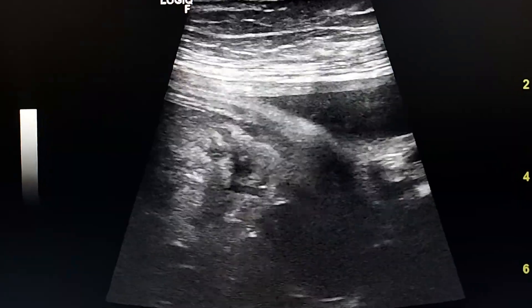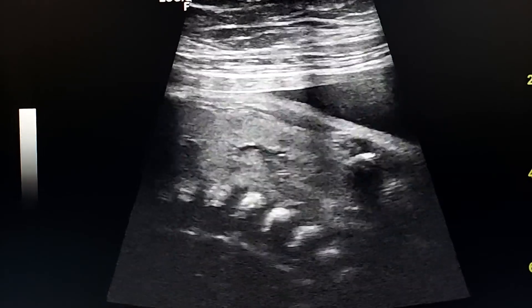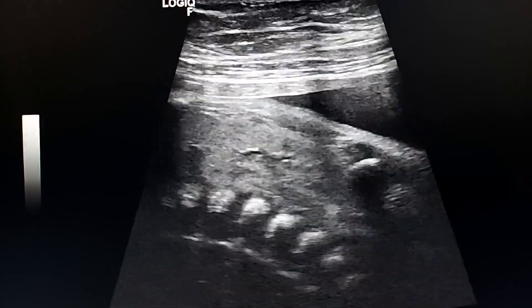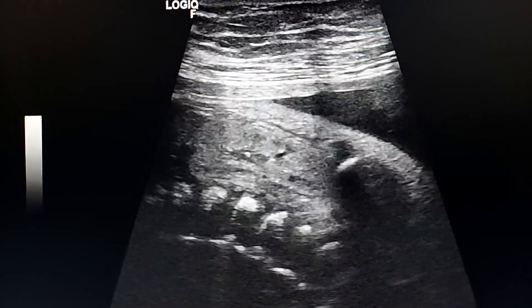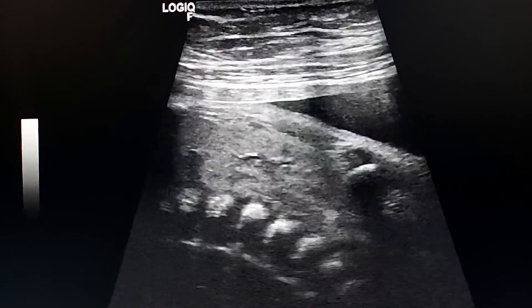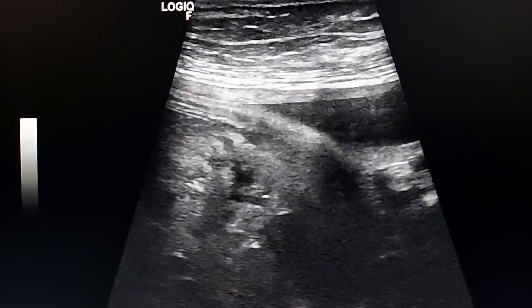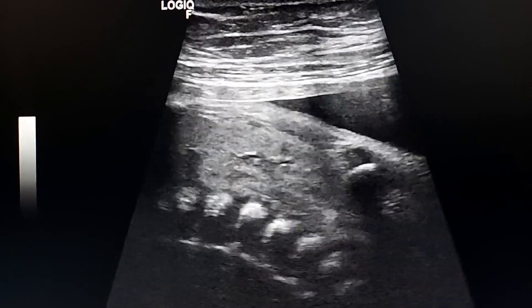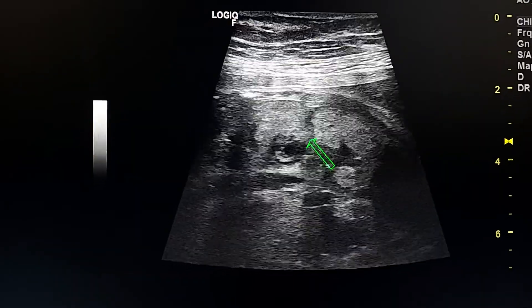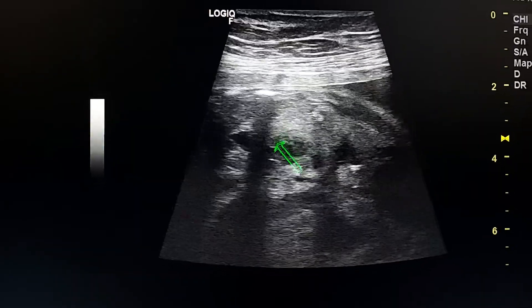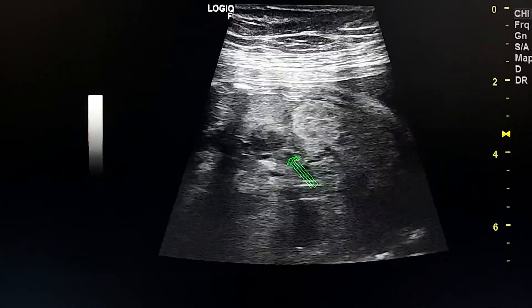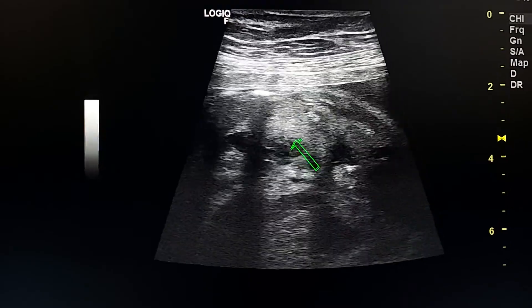Here is one kidney. We see an echogenic cortex with dilation of the pelvicocalyceal system. Here we also see a mass lesion in the left adrenal gland.